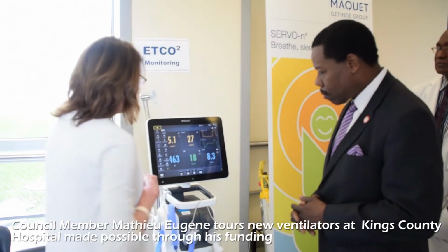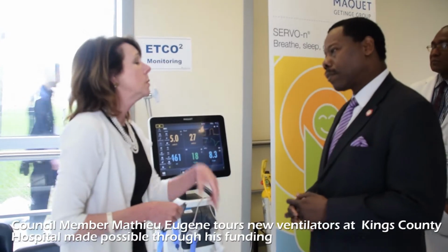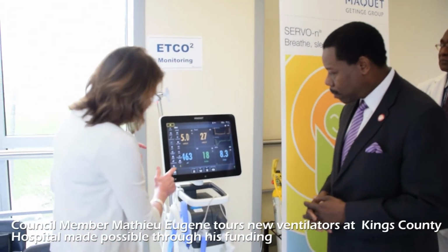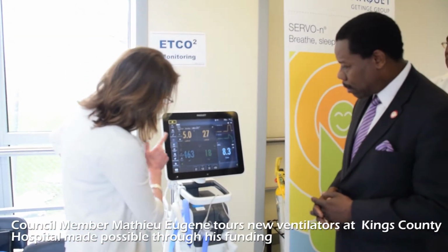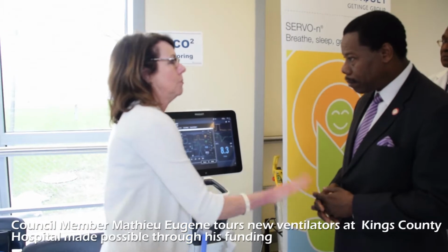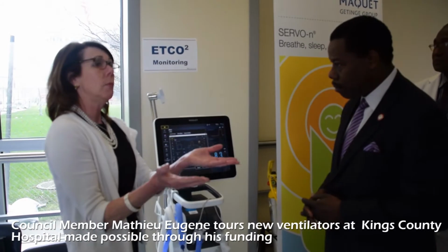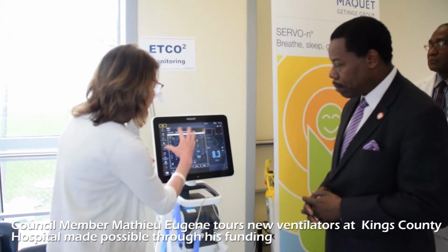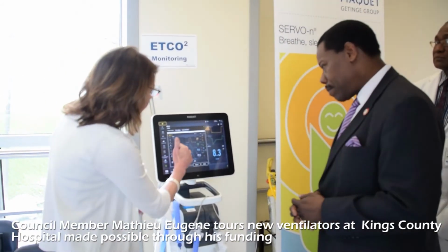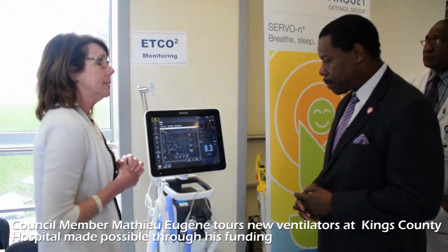As well, a lot of times we can't always convey information to the doctors. We can write down numbers, we can tell them what happened, but there's nothing like a picture to tell you the true story, right? So here, under media, I took a picture of a before and after loop. Now this means nothing to you, but to the doctors, this is gold. They'll be able to see how the medication's working. This is how the patient's numbers were beforehand, and this is how their graphics were beforehand. It's kind of like looking at an EKG, but for respiratory. The blue was beforehand and the white's after. So they can really gather information on this.